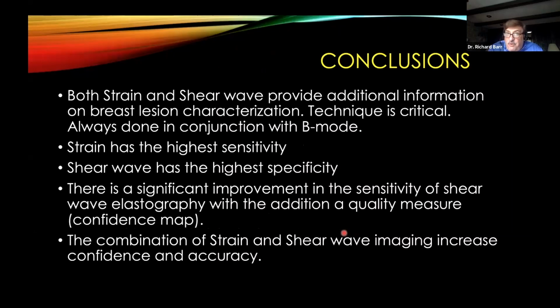But I think it's important to do elastography because if you biopsied a BI-RADS 5 lesion and the pathologist gave you a benign diagnosis and the elastography was suggestive of a benign lesion, I would feel very comfortable that I don't need to do anything else. Whereas if it was a BI-RADS 5 and the pathology came back as benign and strain and shear wave were suggestive of a malignant lesion, then I would say we missed the lesion or something doesn't make sense. We need to do additional work.